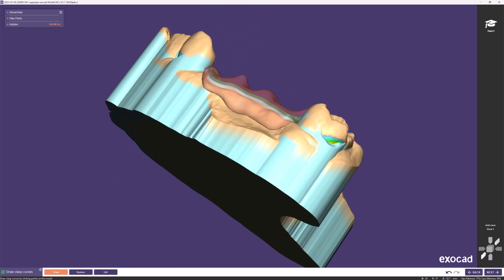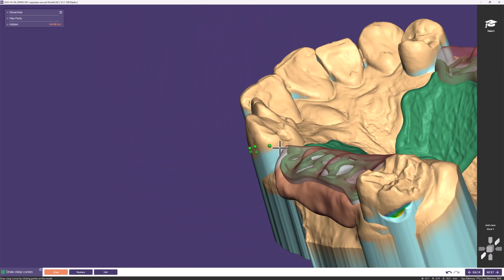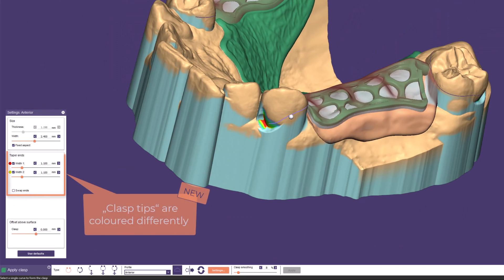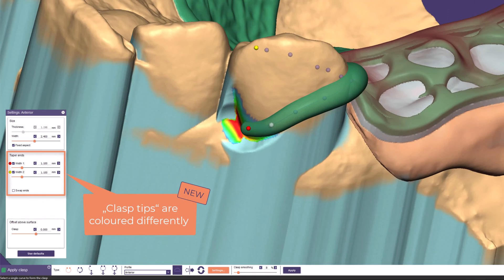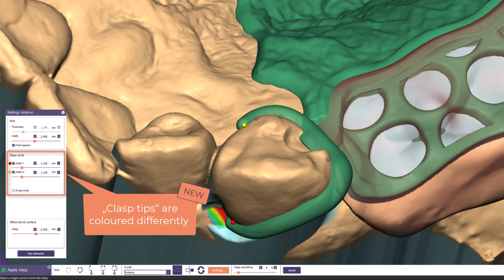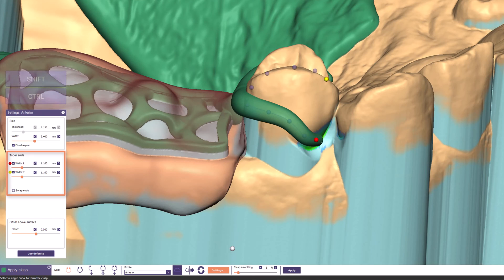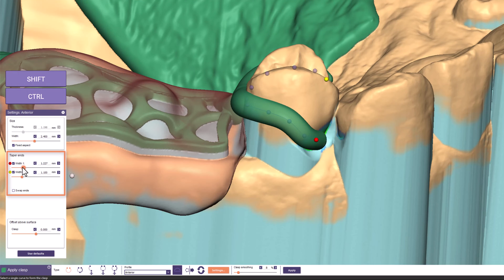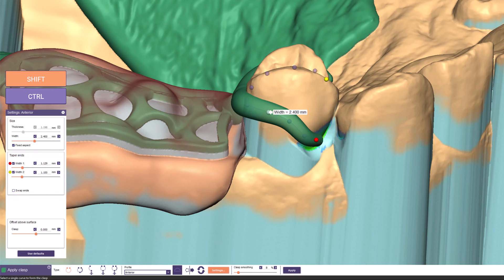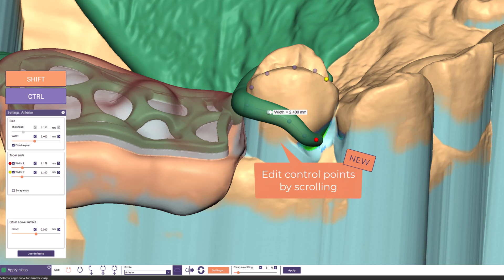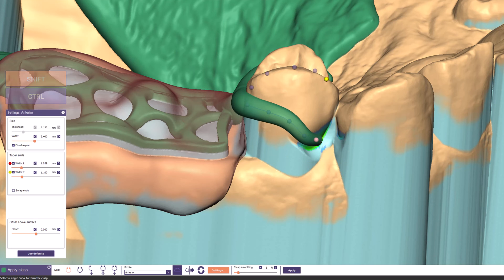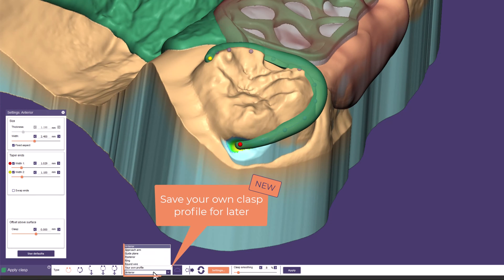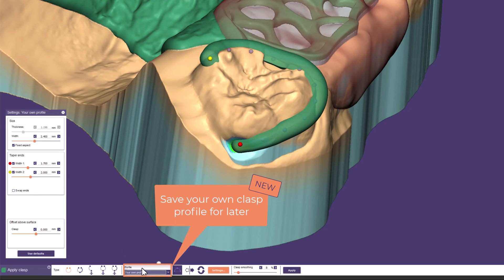Now we draw all our clasp curves quickly and fast-forward to the next step. The clasp tips are colored differently in red and yellow, and a third end would be colored in cyan, helping you see at a glance which part you are changing when setting up tapered ends. You can hover over the control points of your curve — holding Shift displays the width of the clasp, and scrolling with the mouse wheel changes the width or taper end dynamically. You can also save your own clasp profile for reuse in future designs.